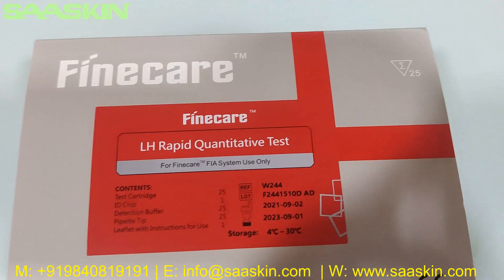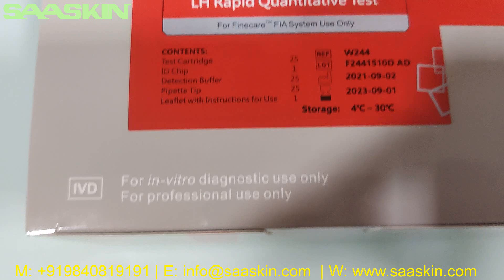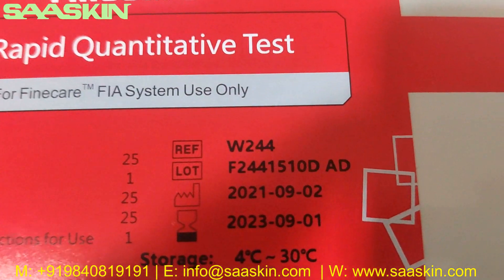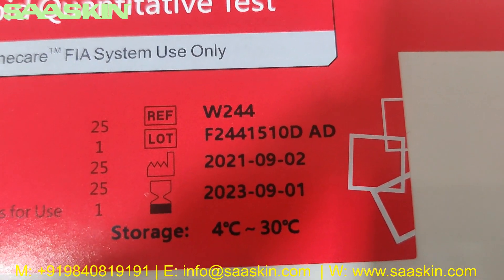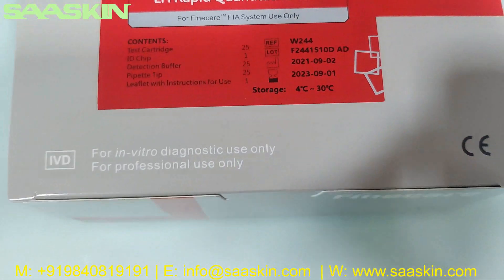This is how the box looks like. This is the 25 test kit pack and a CE IVD certified product. You can see the reference number and lot number, and you will also have the manufacturing date, the expiry date, and room temperature storage conditions.